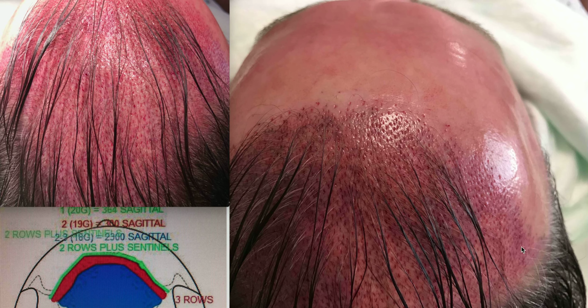Now, as you go toward the lateral few centimeters of the scalp, going over to the side hairs, you want to slowly, gradually transition laterally. There is no abrupt transition on the scalp when you're looking at a natural head. So you don't go from here over to there. You want everything to slowly, gradually turn, but you want that turn to occur really in the lateral centimeter. So you don't want it to be slowly turning from here. Otherwise, everything will book leaf open, and it'll be the opposite of a convergence pattern.